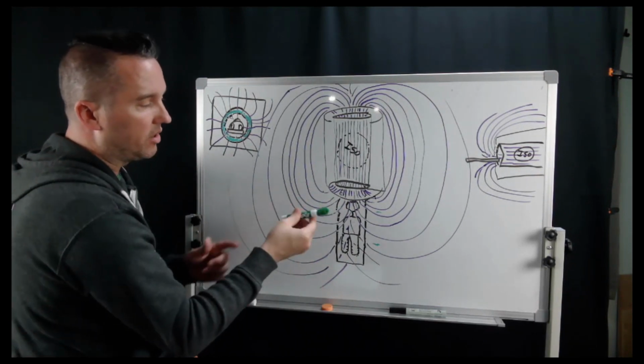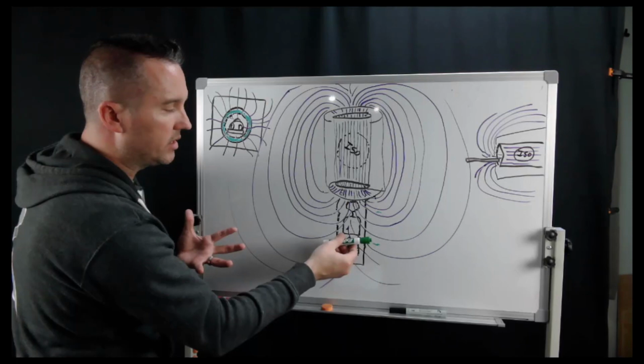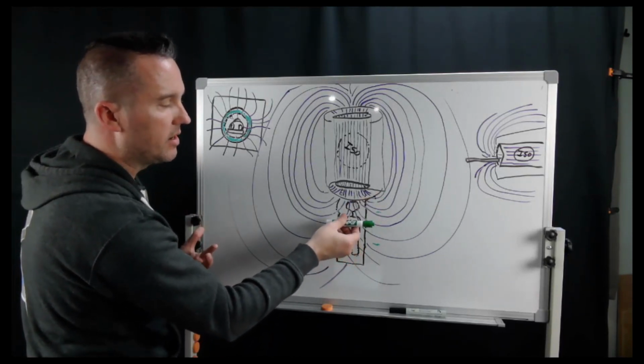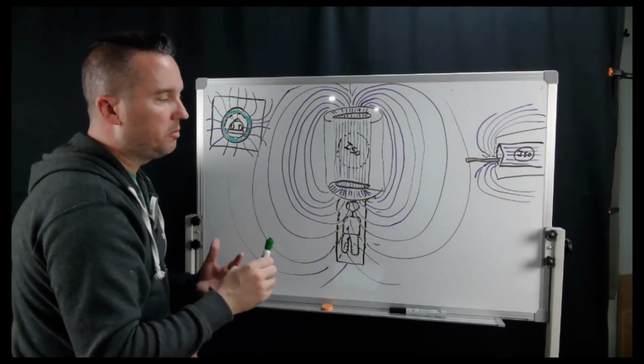However, because this does have a long axis, if I were to take it in, it'll be a combination of translational and rotational force, but here you'll see the long axis will align. So things are a little bit opposite.